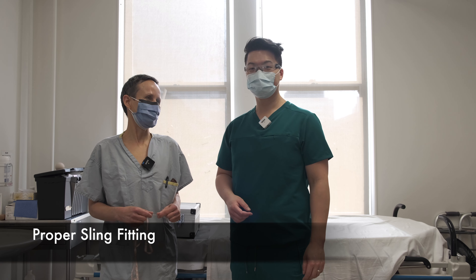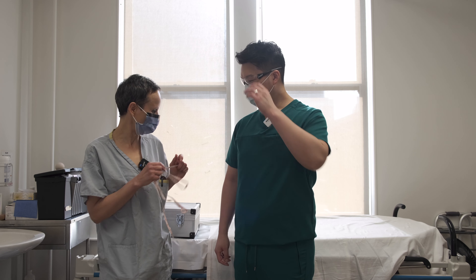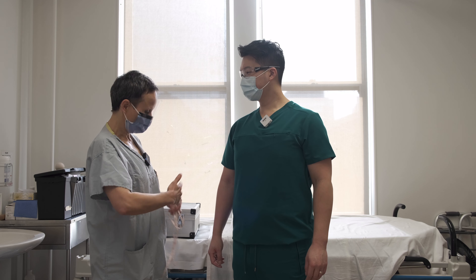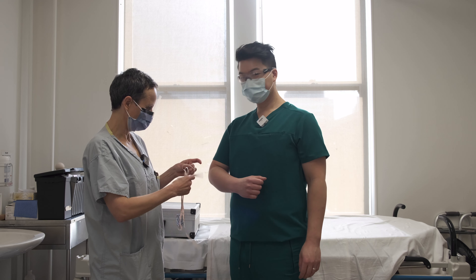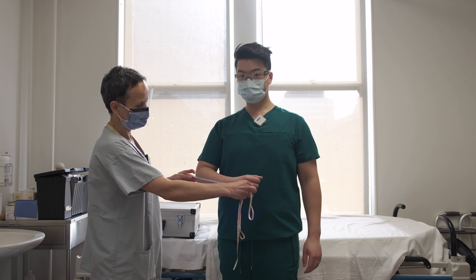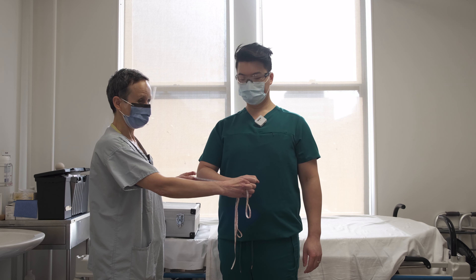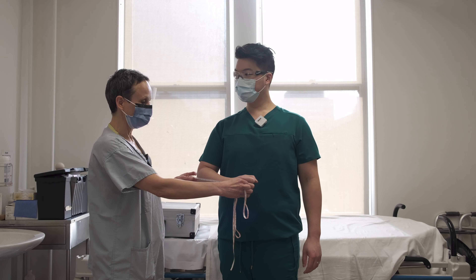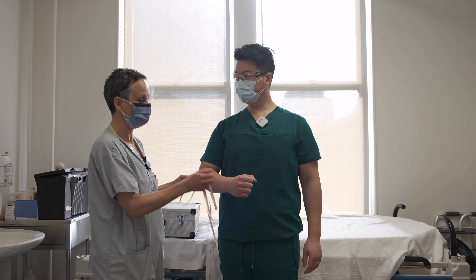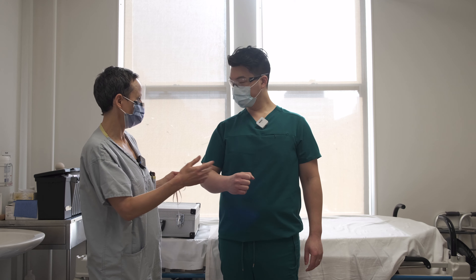The first step to make sure that you have a good fit with your sling, we need to measure your arm. We'll pretend your surgery will be on your right side — put your elbow up like this, and I'm going to measure from the elbow all the way to the knuckles of the finger. The sling needs to be a little long at the wrist because they always travel backwards, and you want really good support in your wrist. Based on that measurement, you need a size large.